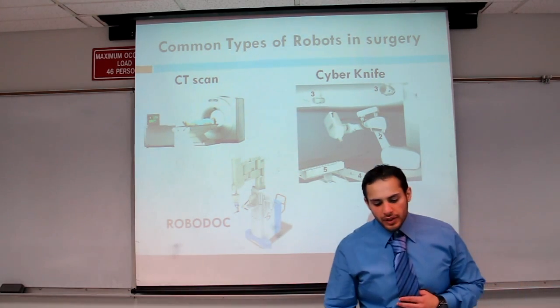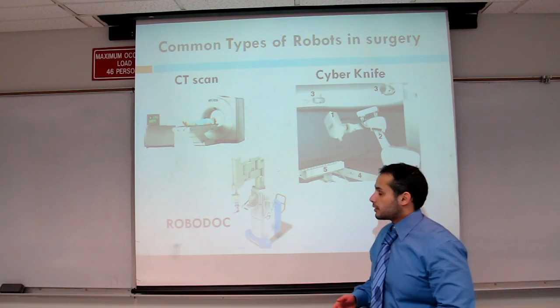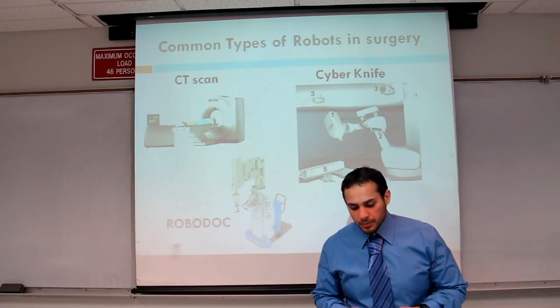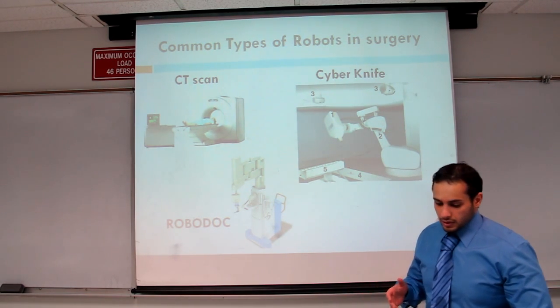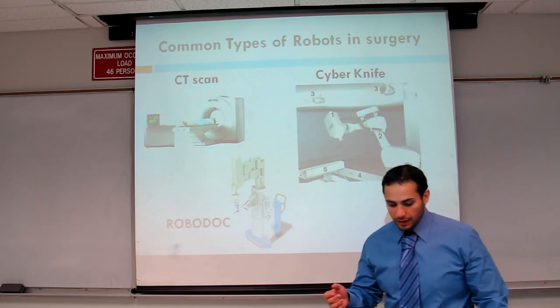We will start first with a CT scan. Computed tomography is a familiar imaging modality in which a manipulator articulates a scanner to different locations to obtain various cross-sectional images of a human body. One of the companies, Zeta Medical Technology, is one of the pioneers in production of CT scans.